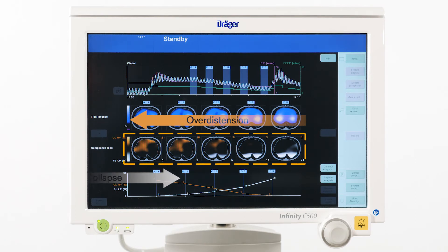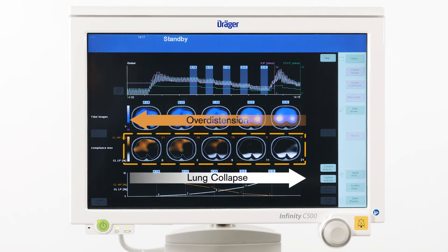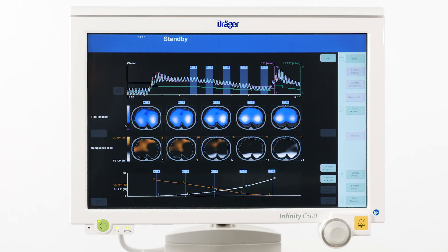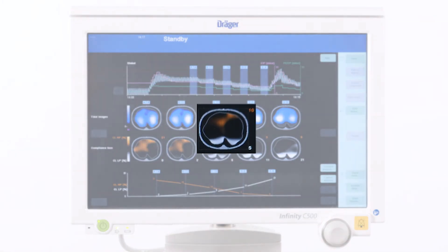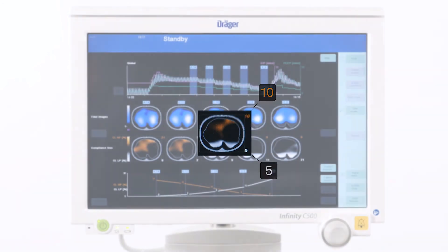In contrast, the loss of compliance towards lower PEEP levels, typically caused by lung collapse, is displayed in white color. Next to the maps of compliance loss, the associated parameters also allow a quantification of those conditions.